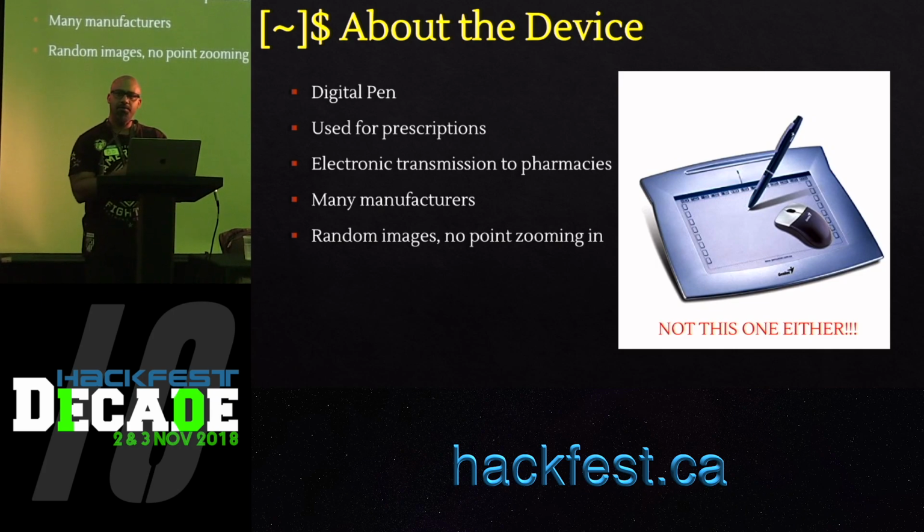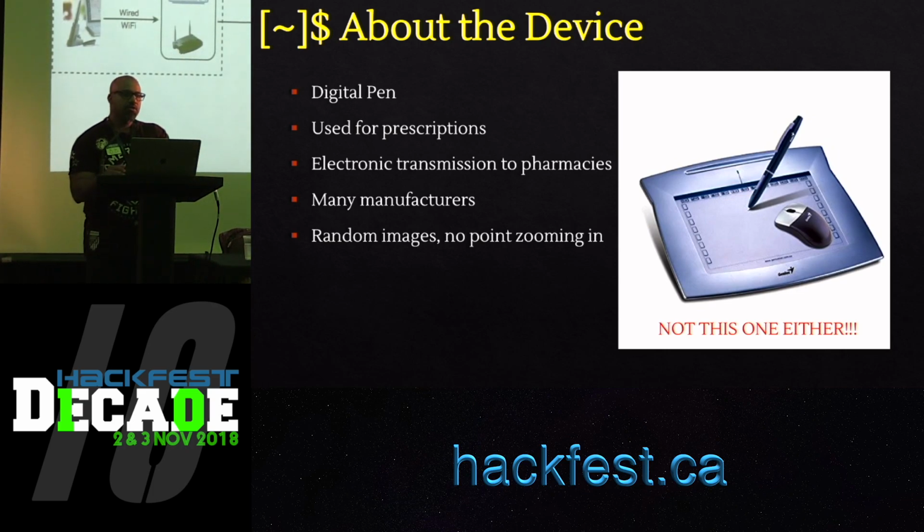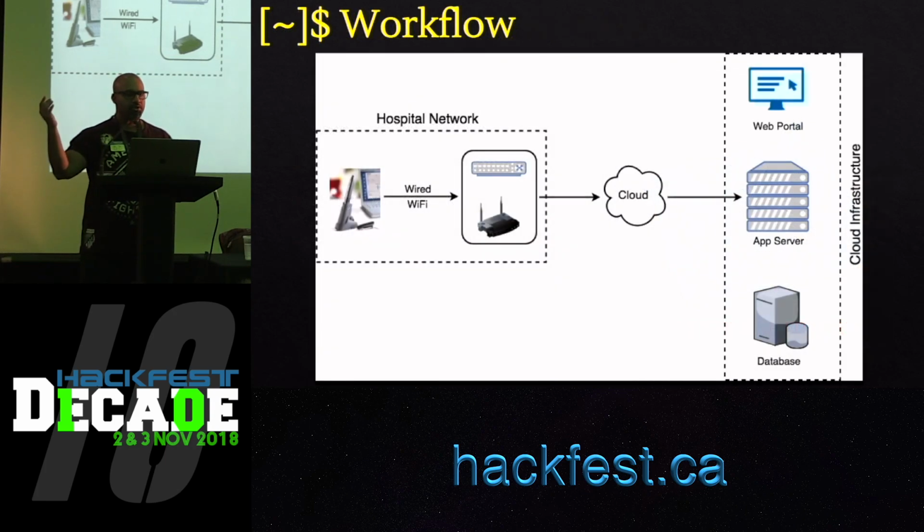We only looked at one device from one manufacturer. Also, this image is random as well. So from the workflow perspective, the pen or the device would connect to the hospital network using wired or wireless protocols, and then it will take the information which is written by the doctors and transmit it over SSL to the application server, which also exposes data through a web portal.